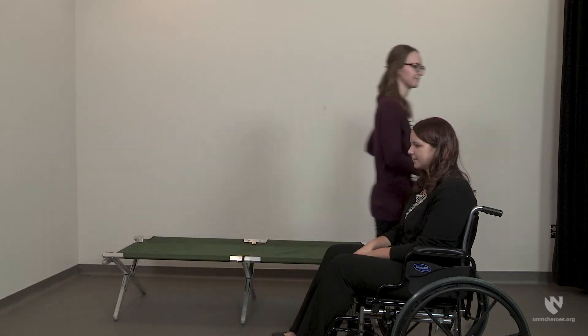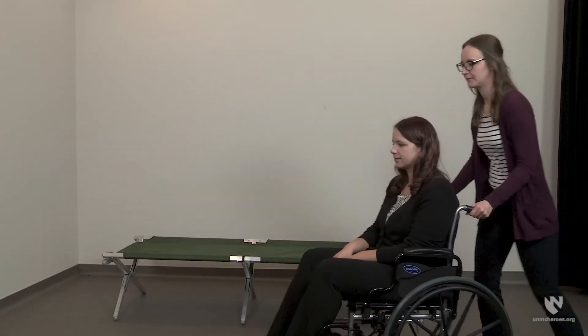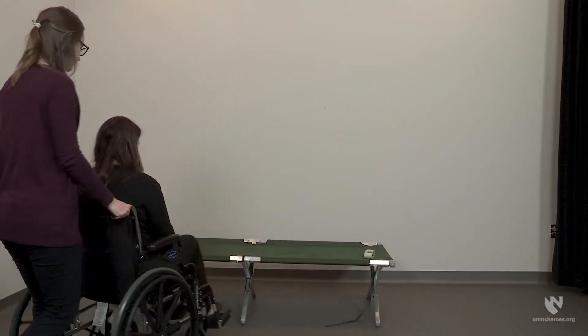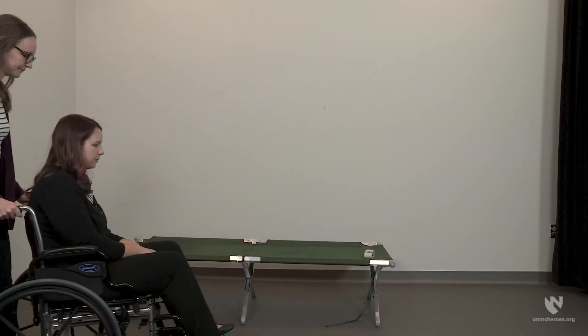This technique may be useful for people who have weakness in their legs, which prevents them from standing. Begin by asking the individual if she has a stronger side. If so, it is often easiest to transfer toward that side. Position the wheelchair so the individual's stronger side is closest to the cot. If the individual does not have a stronger side, it doesn't matter which side is closest to the cot.